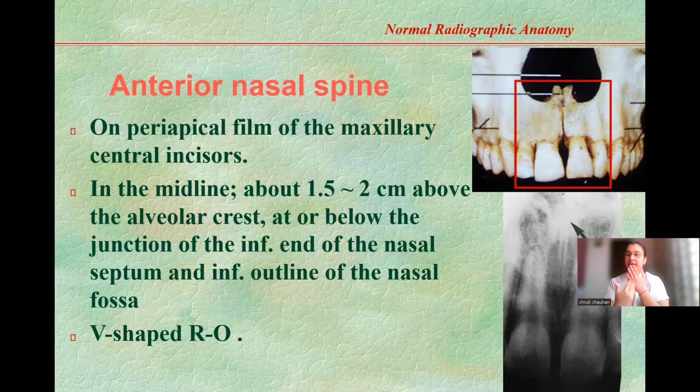Okay. So if the X-rays are going to hit on some structure and pass, and they're going to hit on some extra structure and pass, which side will be whiter? जहाँ डबल चीजें रोक रही है वो वाला एरिया ज्यादा वाइट दिखेगा हमें, राइट? And जहाँ सिंगल चीज रोक रही है वो वाला एरिया हमें कैसा दिखेगा?